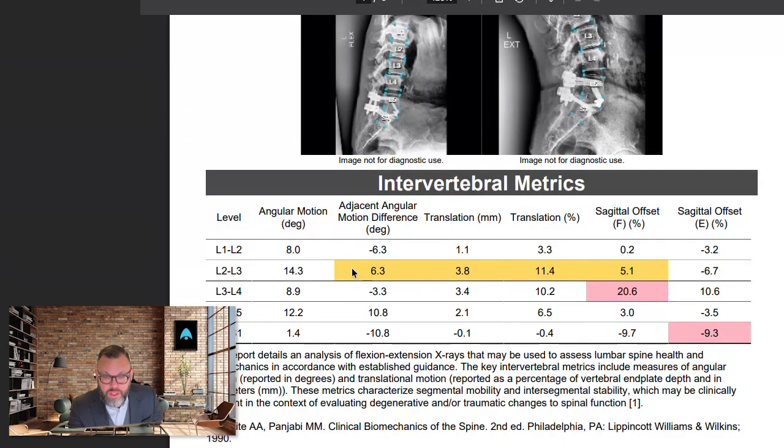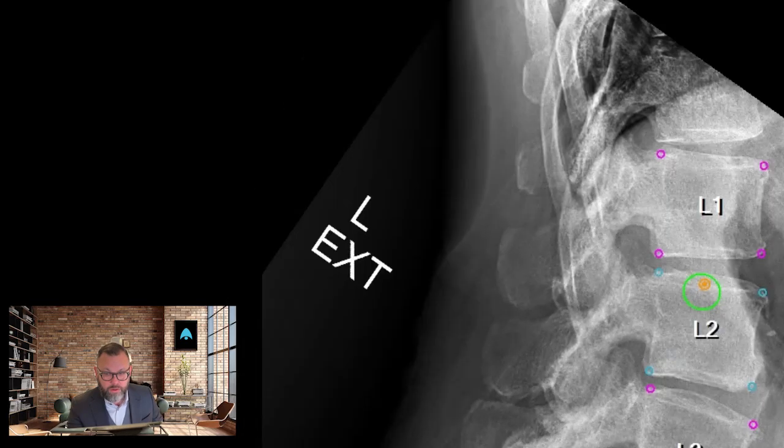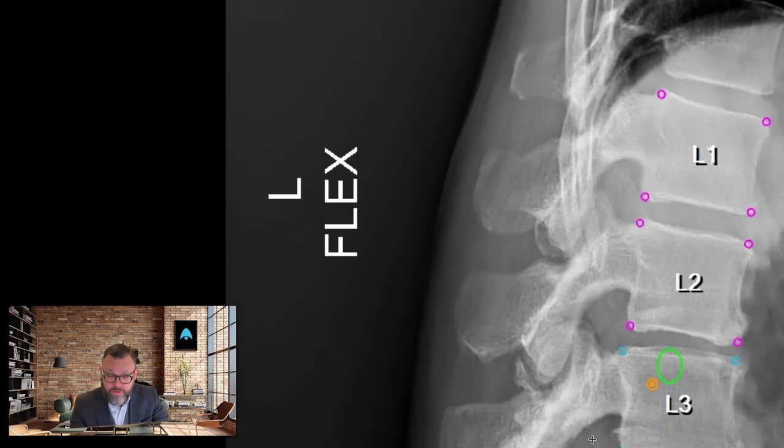And when we look at the gold, what we see here is she hasn't reached AMA threshold levels for a diagnosis of 25% whole body impairment in AOMSI, but she's pretty darn close. What her problem really is, is the instability at the fused level, L5, S1, and the significant instability above that, right? Those together don't necessarily qualify for an AMA impairment rating, but these are disabling movements. And let's go through this one more time. And as I mentioned, this really helped me to testify on her behalf. And this L4 on 3 is the bad actor right here. And this is the segment.